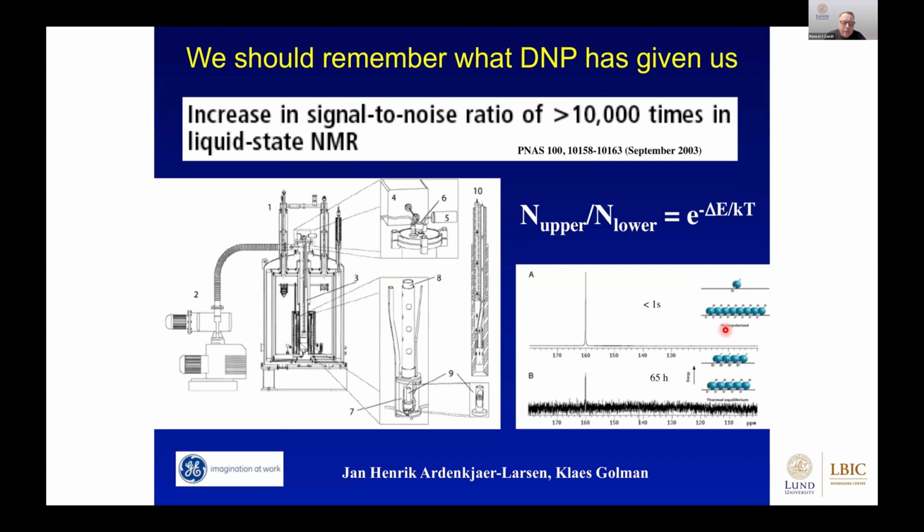If you look at the very first prototype here, from the group in Malmö, South Sweden, it's an engineering project. Vacuum pumps, you have to get it under low pressure. You're working with liquid helium. You work with microwaves. But in the end, if you get the sample out of this system after a while, it's proven to work, because this is a spectrum, almost 3 days of scanning, with this signal to noise, and this is a single scan. So it's a dramatic increase of signal to noise.